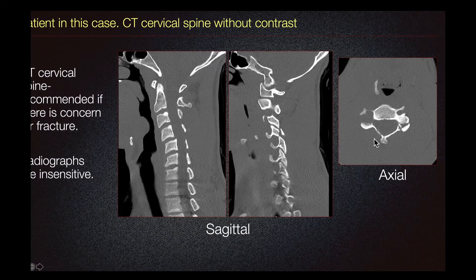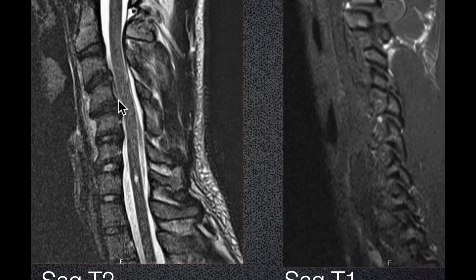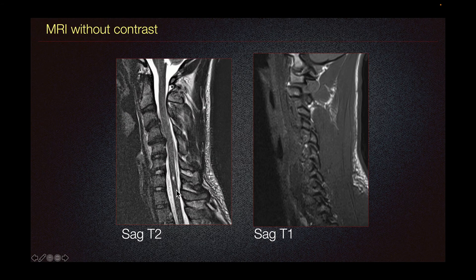The patient underwent MRI without contrast. Here we can see some disc bulge at C3-C4, and also the anterior listhesis of C4 over C5 with uncovering of the disc at this level. There is also mass effect on the anterior thecal sac and the anterior aspect of the spinal cord at this level. No abnormal cord signal is detected. Additionally, there is an incidental note of a focal syringomyelia at the level of C7.